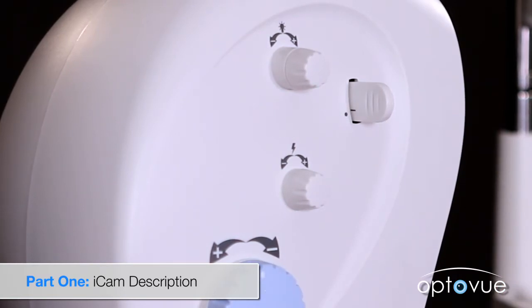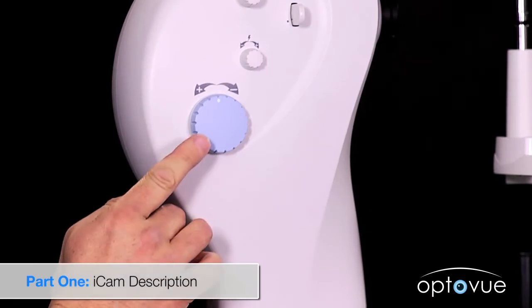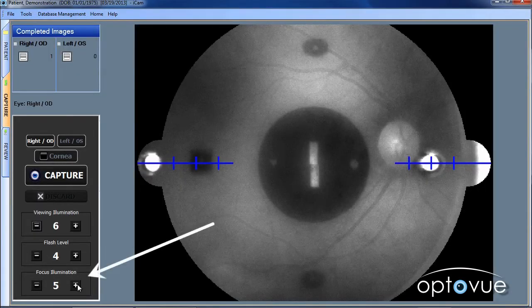The last of the controls on the camera is the large blue knob which controls the split focus. The computer screen has a final control: the focus illumination, which controls the intensity of the split focus projection.